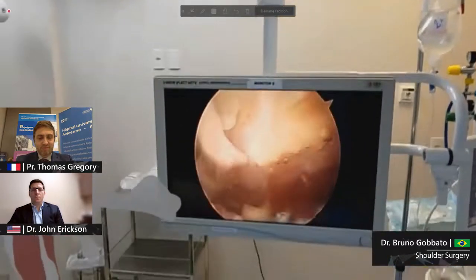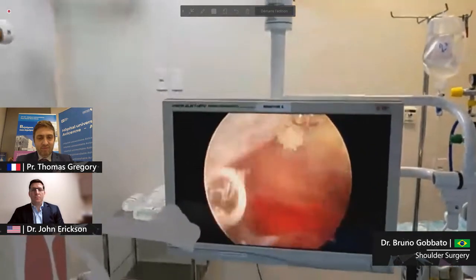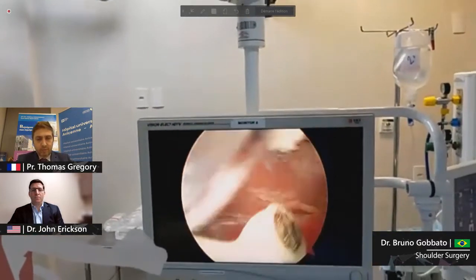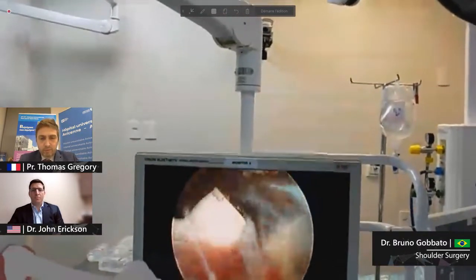So I really suggest, of course, using the Heads Up app that was developed by Evolutis. It's an amazing app. The tracking for the model is amazing. But I think we should always start with some very easy surgeries. And that's what I'm doing today with you guys.